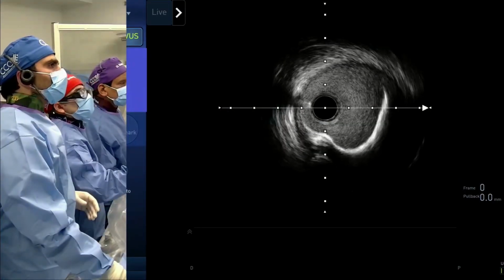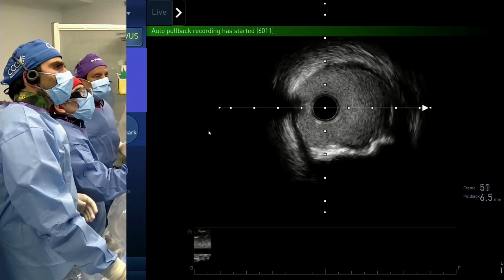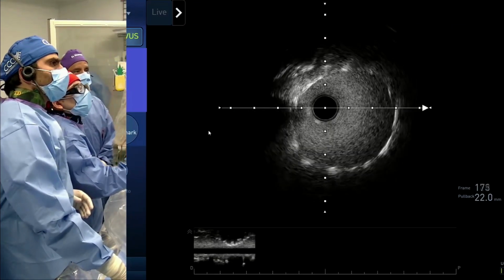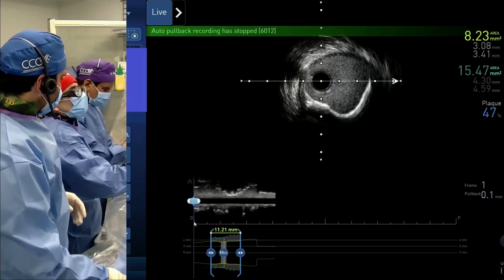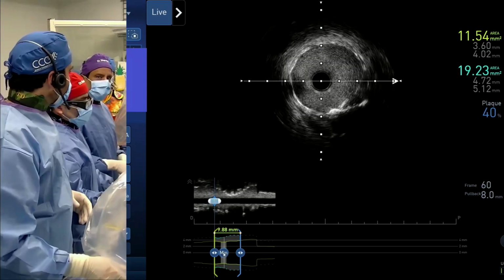You know, ironically, the place where you really need the IVUS is the native ostial circ. That's where it always comes back eccentric, but that's the hardest place to get the IVUS. Really nice result. Nice reaction. Yeah. That's good. All right, just show it and we are done. Is this IVUS towards the LAD or towards the circ? LAD still will remain the LAD, yeah.